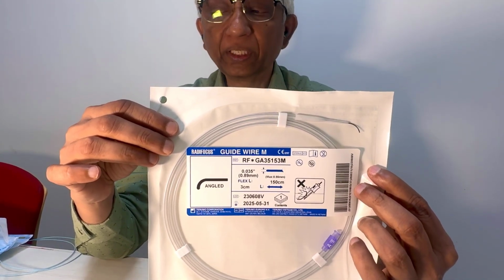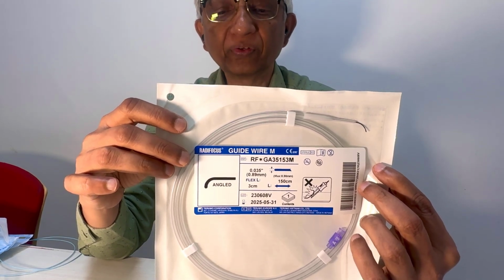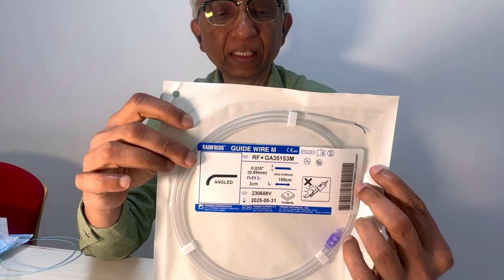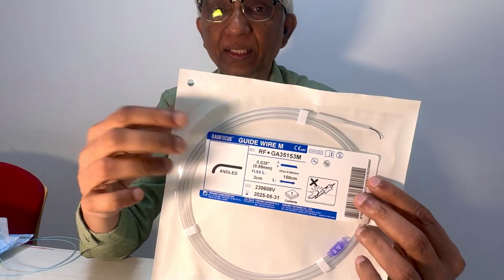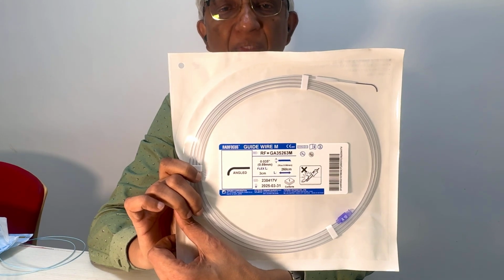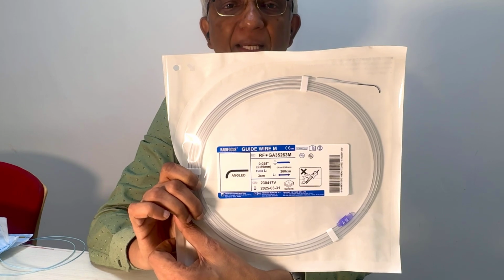150 centimeters. Okay, I'll get you some more covers just to make you understand the length of different catheters. So this can be comfortably used in a catheter which is 80 centimeters and 100 centimeters. At 125 centimeter catheter, you have just 20 cm left out and can be difficult. Now look at this. This is 260 centimeters. 260 centimeters means you got 60 centimeters of extra length when you do an exchange.